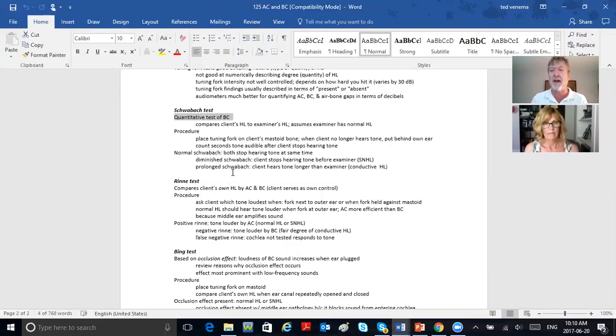That's why they have hearing instrument practitioners like us, because we have audiometers, and audiometers are calibrated in decibels, which are very good at telling degree of loss. But the big B-U-T, tuning forks are phenomenally good at detecting the type of loss. Okay, so there's your 4 tuning fork tests: the Schwabach, the Bing, the Rinne, and the Weber.